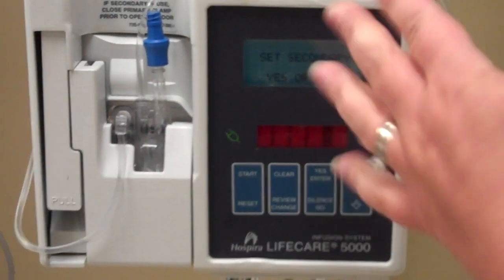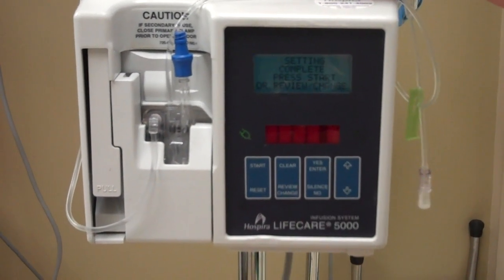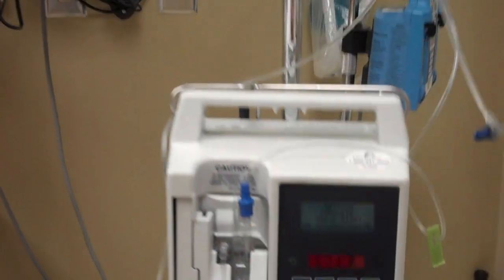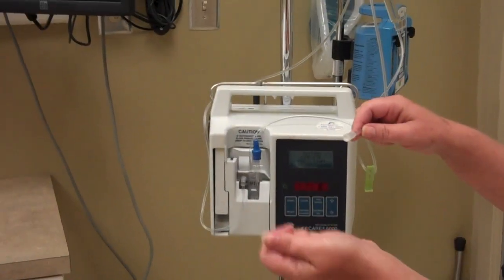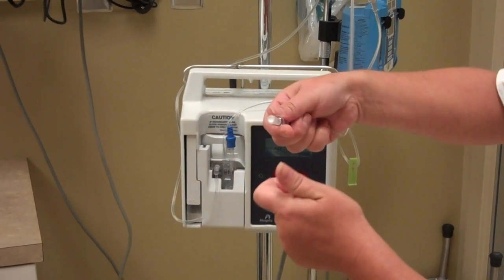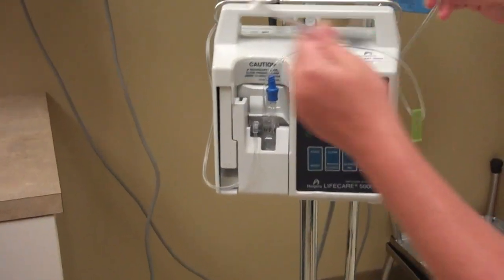It's asking me to set secondary, and I'm going to say no right now because I'm not going to set a secondary. Your primary is complete. Of course you would wipe off, flush your patient's IV, wipe it with alcohol, flush it. Then you take off the plastic end, screw this into the patient, and press start. This is what it looks like when it's running.